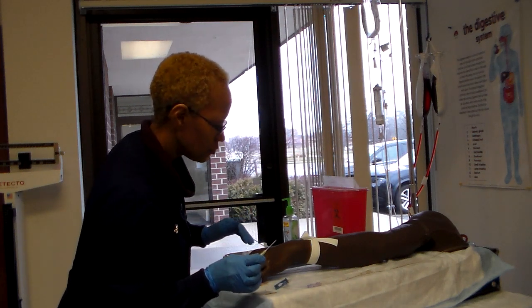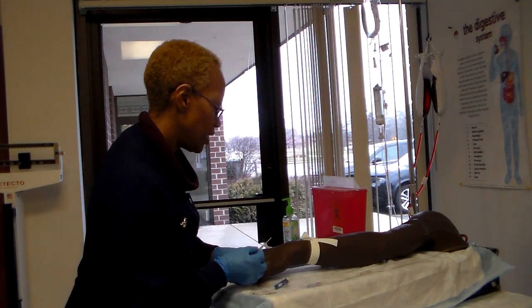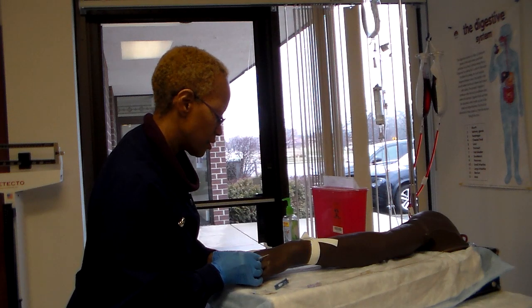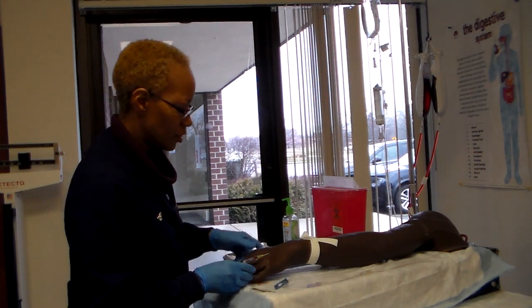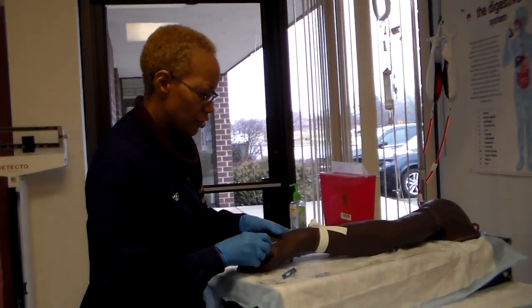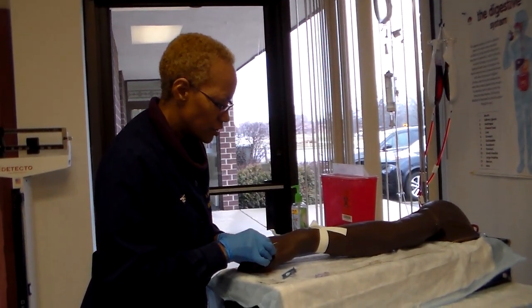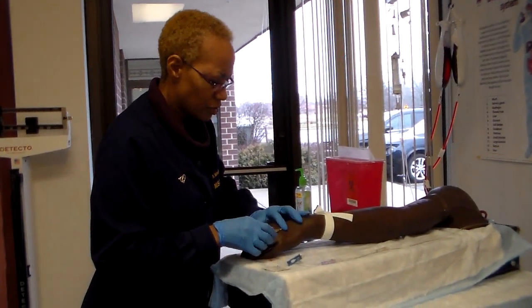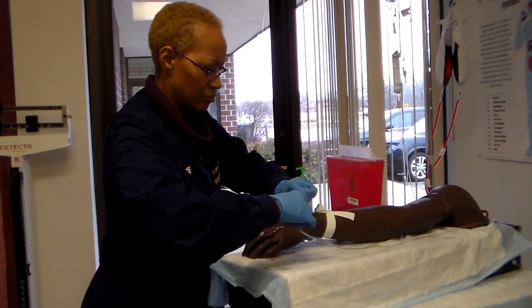Okay. You're going to hold down your site, and you're going to insert at a 30-degree angle. Okay? You should get a flashback. Okay? You're going to pull back your stylet, and you're going to advance your catheter. Okay? Good.